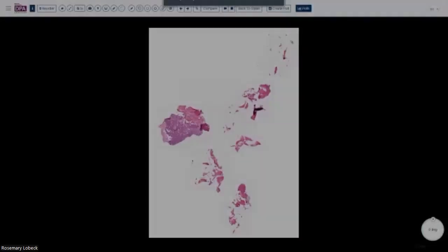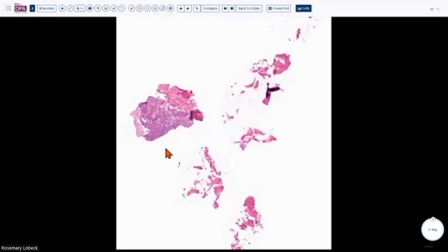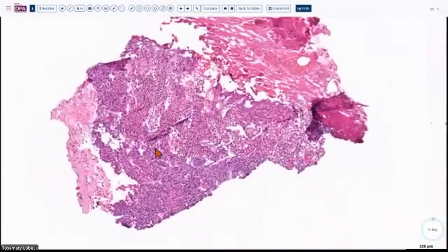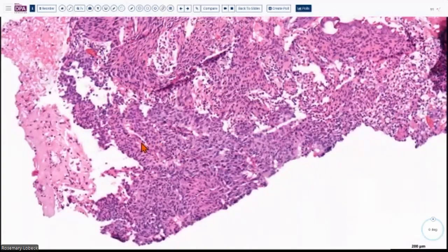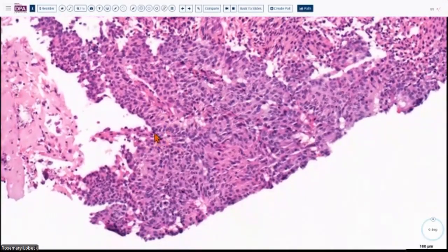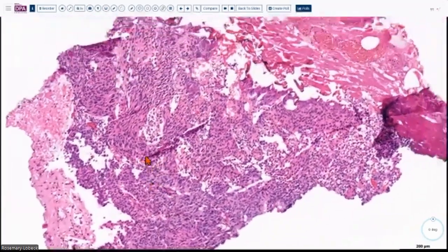So, yeah, we discussed that there is clearly osteomyelitis, but we want to look at the elephant in the room, right? So this tissue. So what's going on here? So I show this tissue to any of our residents who are on the GU service and ask them what this is, and they're going to say non-invasive papillary urothelial carcinoma, probably low grade, and they're like, oh, there are umbrella cells here, there's a papillary formation here. The additional thing I want to point out here is that, you see this?